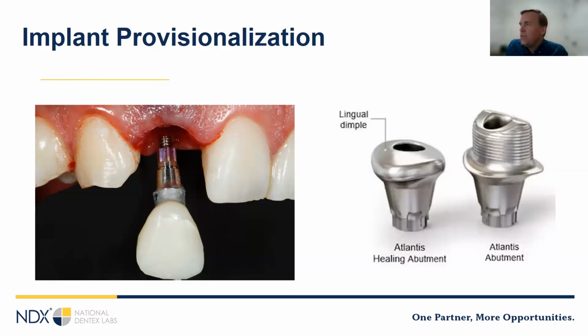I mentioned this because this is the only one I know of where you can input your planned position, get an ideal emergence profile from your laboratory, and then when you get the final abutment, the emergence profile will be exactly the same.